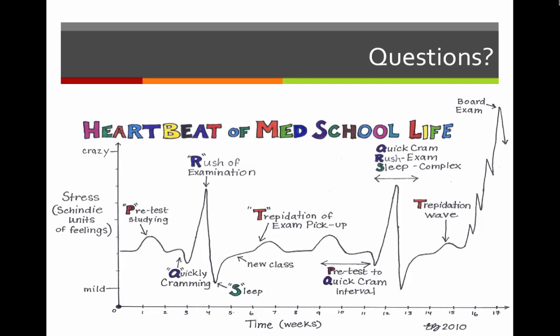So that's the XYZs of 12-lead analysis. Again, you've been through the ABCs ad nauseum. You know the ins and outs, you know the mundane stuff of 12-lead. Hopefully this was a bit interesting to you, and hopefully you go through it at least once or twice a year. I know I do, just to keep myself up to date. And like we said at the outset of this, hopefully save a couple patients and improve the outcomes of other patients by catching a few things that we might otherwise miss.